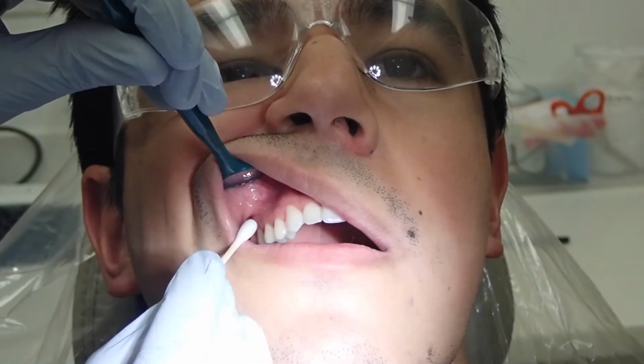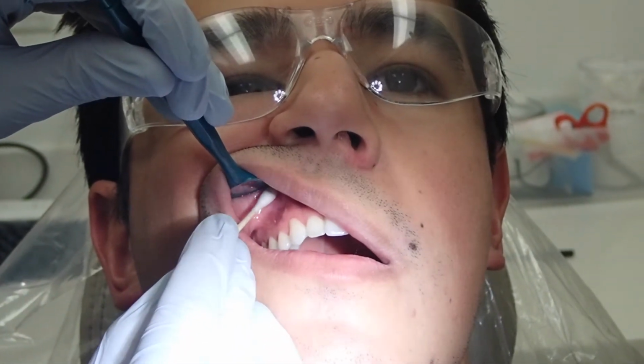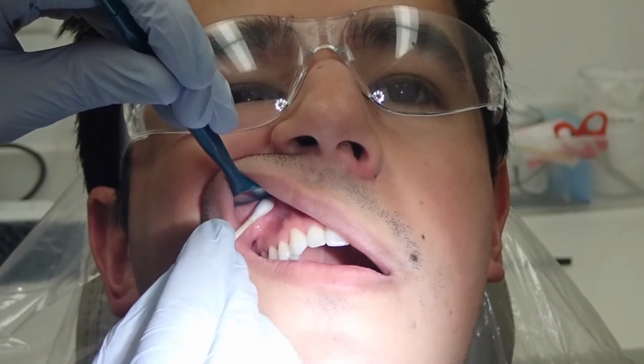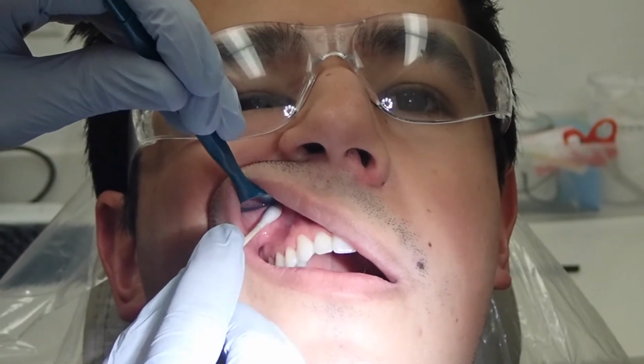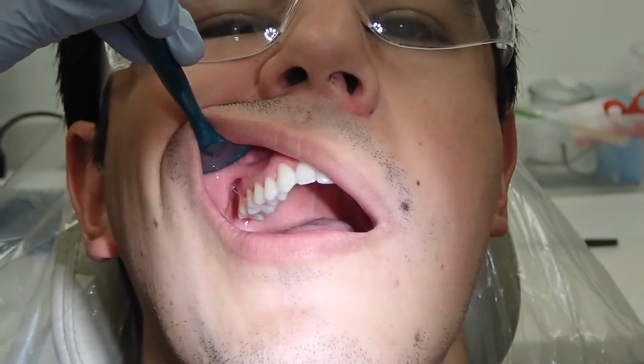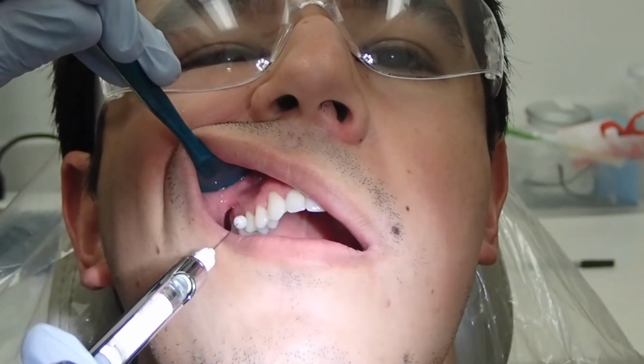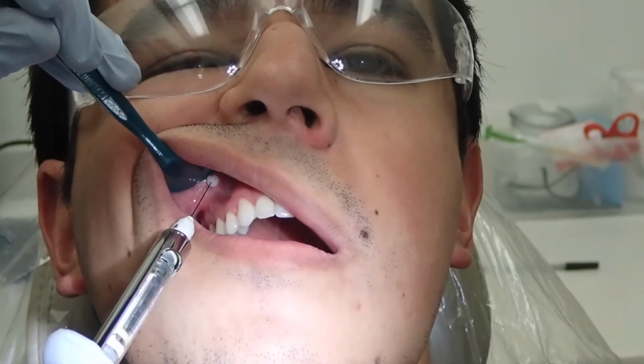Your anatomical landmarks for performing the MSA are the apex of the maxillary second premolar and the height of the vestibule. Be careful not to inject directly into a frenum attachment. The recommended needle length for this injection is a short 25 millimeter needle, and your depth of penetration should never exceed 1/2 of the needle's total length.